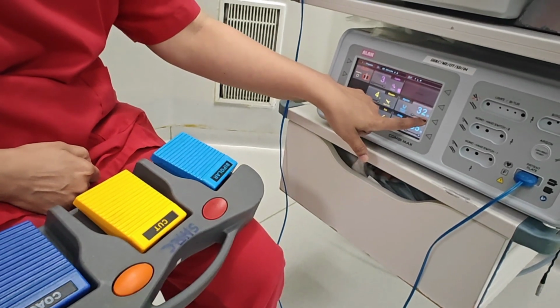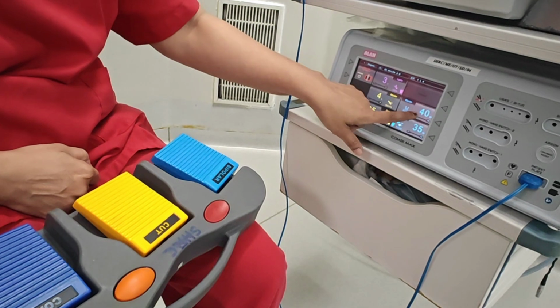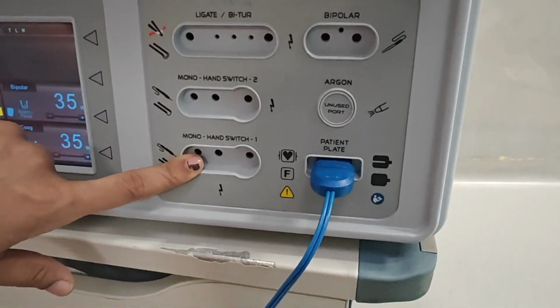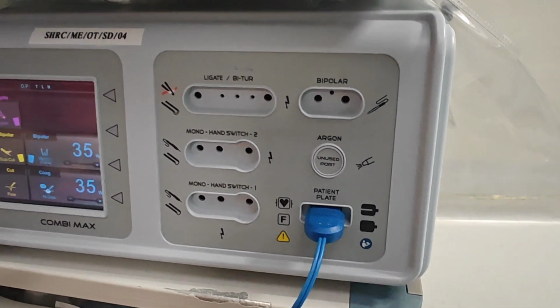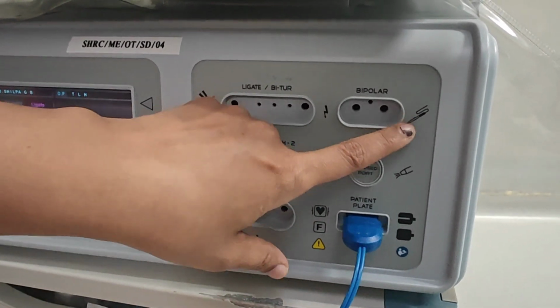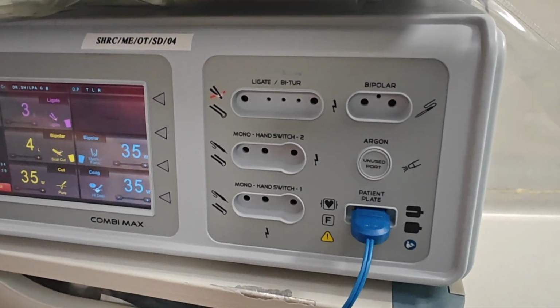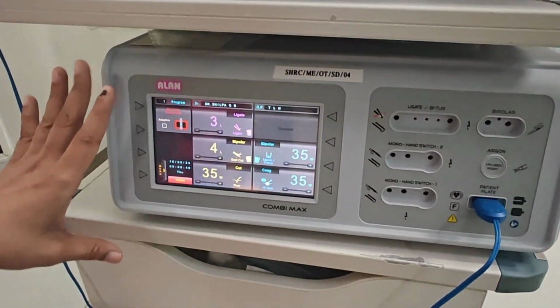This can be changed, that is the coagulation can be changed anywhere between 1 to 100. So I usually keep it at around 35. These are the cable connections, and the top one is for bipolar and the bottom one is for monopolar cables. And this is for the open instrument where the bipolar has to be connected. This is argon laser, which is not of much use. There is a patient plate connection, which is connected as of now with the blue wire.